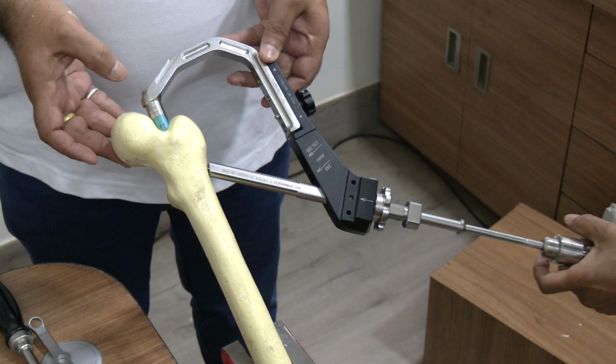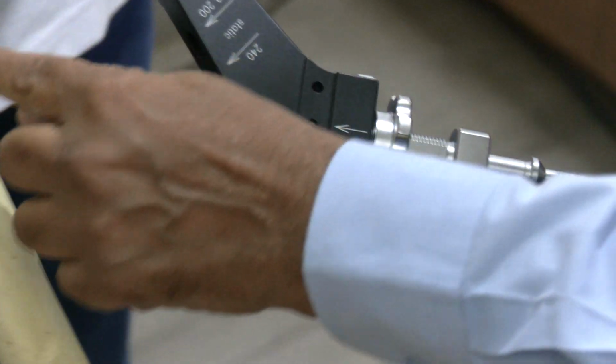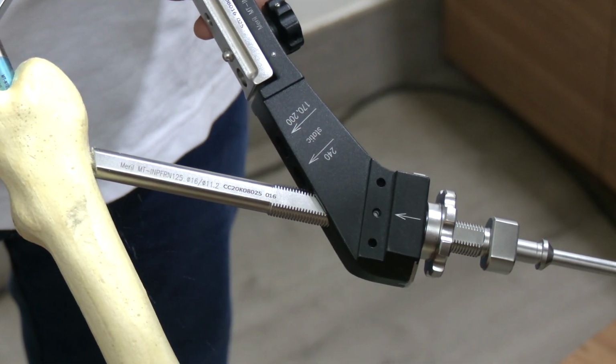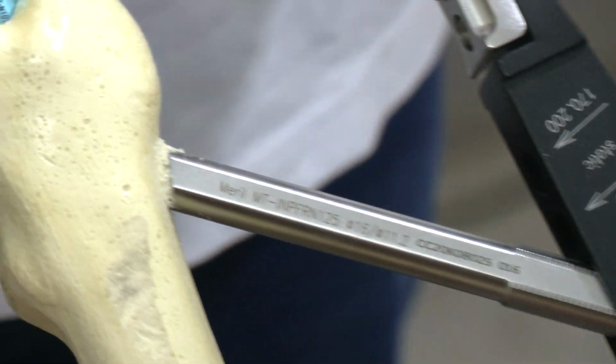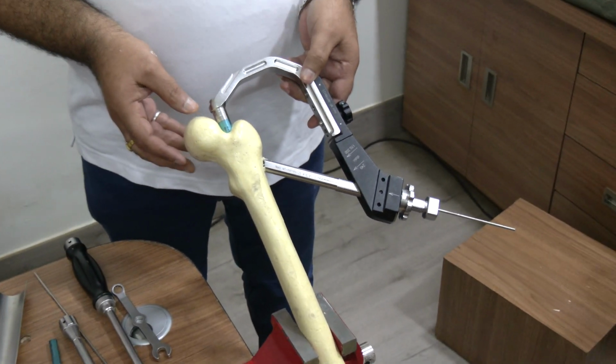Now you can see there is a stopper here. This is touching the lateral cortex. Only this much amount of reaming you will be doing. That's all. It has removed the lateral cortex bone, and now the work of this instrument is over.